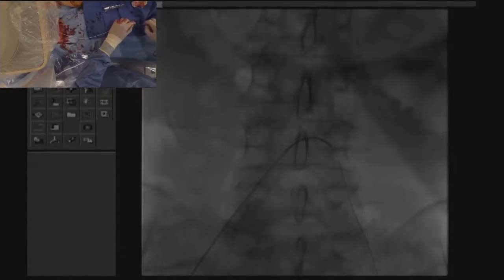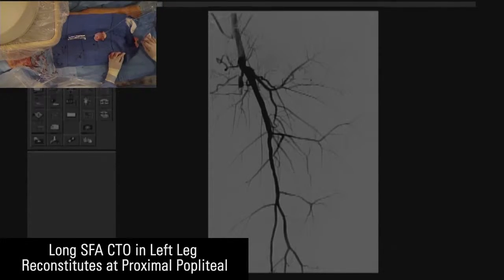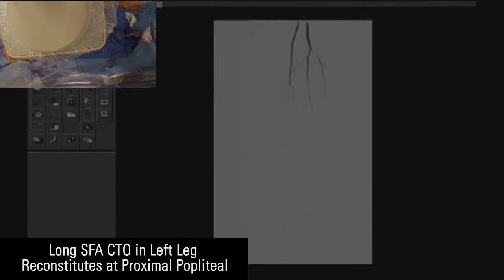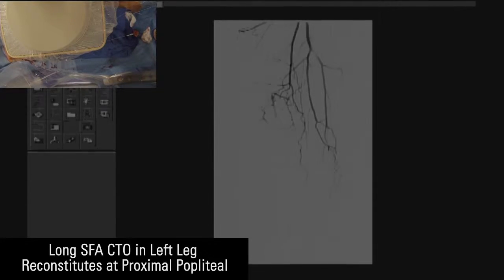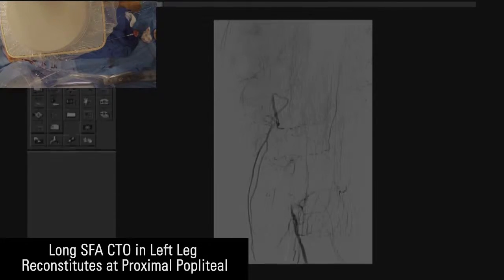In this case, we're using a rim catheter with a glide advantage wire and doing selective angiography of the left lower extremity. The CTO, as you see, is just after the takeoff of the superficial femoral artery. There is an island of reconstitution in the middle of the vessel and then reconstitution beyond the adductor's canal within the proximal popliteal artery.